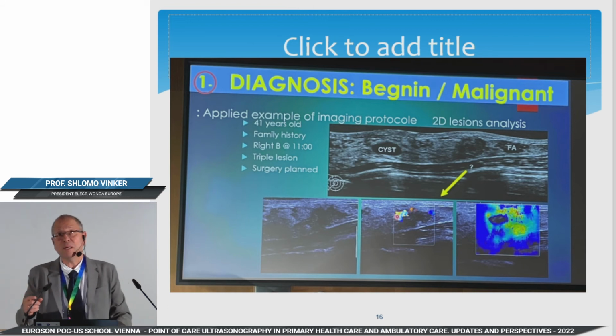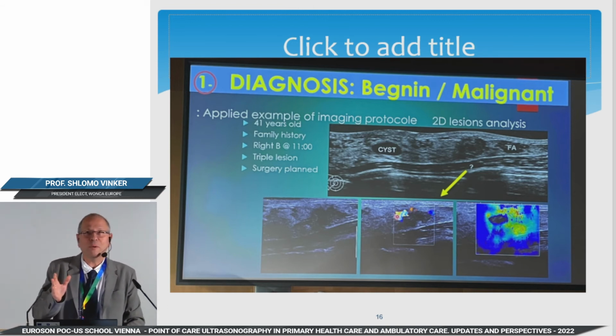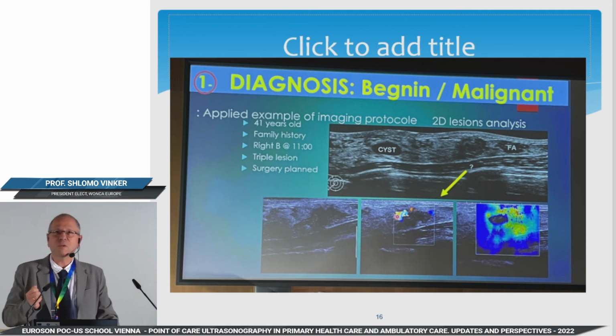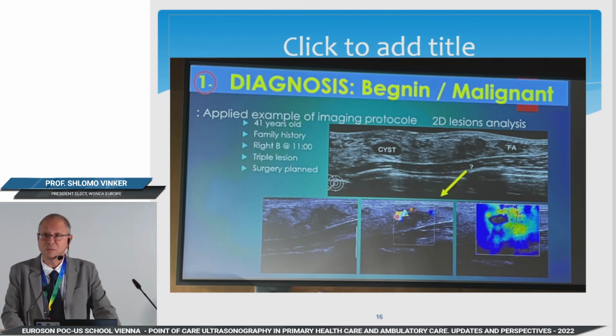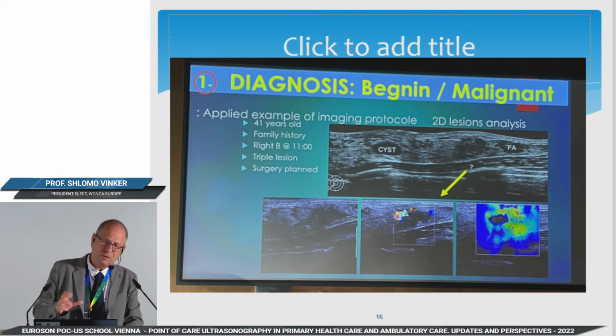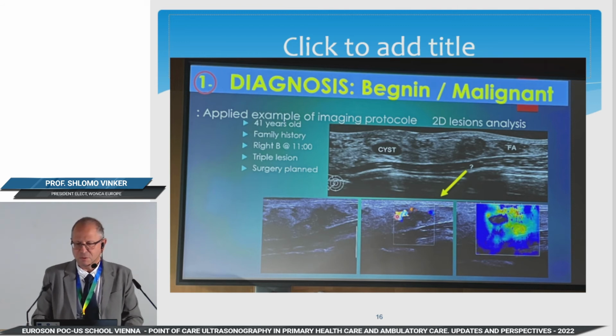But at the end, when we saw that the pressure makes the difference, I was a little bit worried because if you are not qualified enough, then you can produce a lot of false positive and negative results. So this elastography is not only the machine, again, it's also the operator, which is very critical. So again, practice and do only things that you are qualified in.